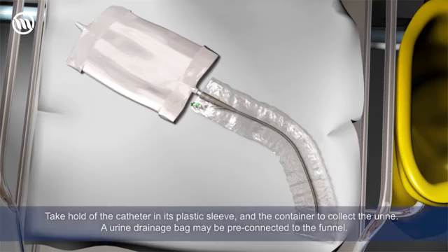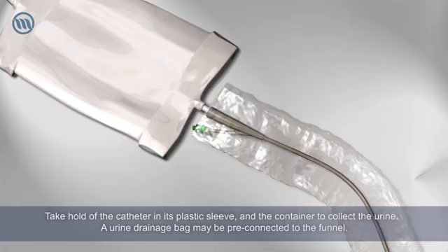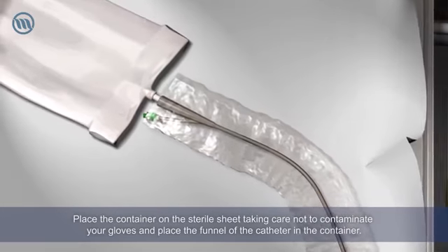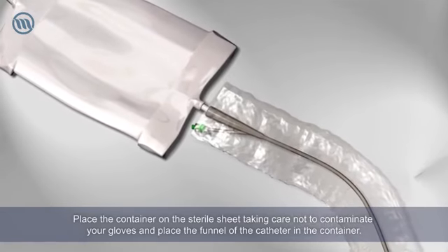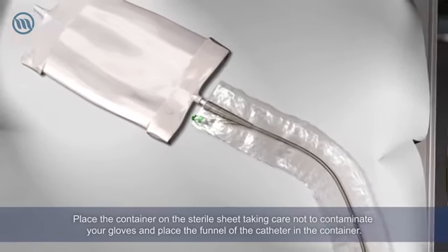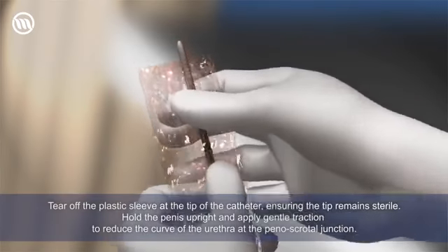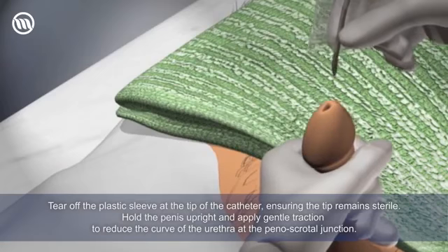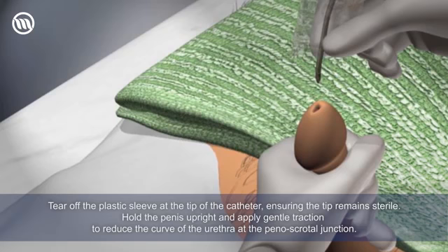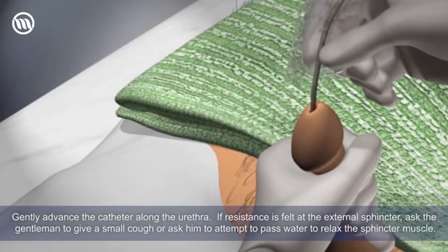Take hold of the catheter in its plastic sleeve and the container to collect the urine. A urine drainage bag may be pre-connected to the funnel. Place the container on the sterile sheet, taking care not to contaminate your gloves, and place the funnel of the catheter in the container. Tear off the plastic sleeve at the tip of the catheter, ensuring the tip remains sterile. Hold the penis upright and apply gentle traction to reduce the curve of the urethra at the penile scrotal junction. Gently advance the catheter along the urethra.